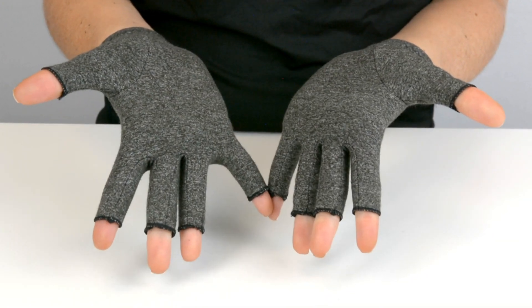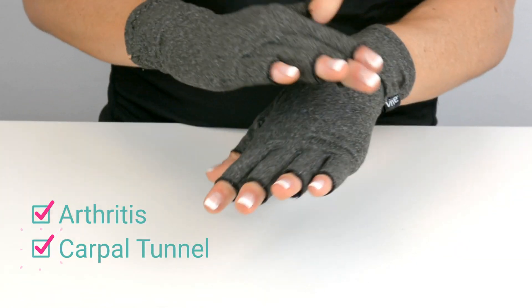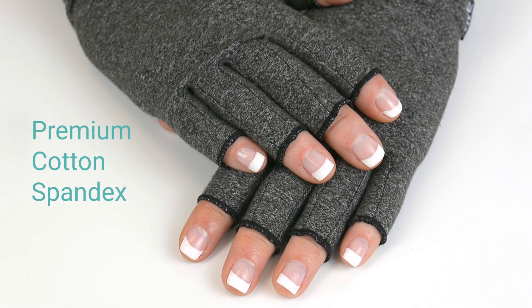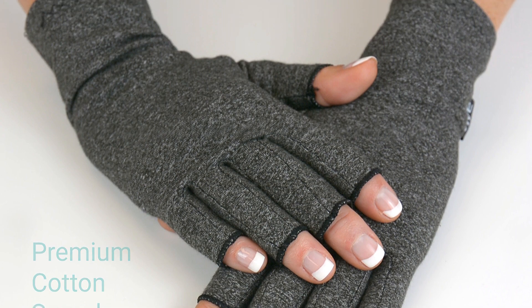The Arthritis Gloves by Vive are designed to provide targeted compression therapy for arthritis and carpal tunnel. Premium cotton spandex material embraces the natural shape of your hands, relieving tendons, muscles, and joints.